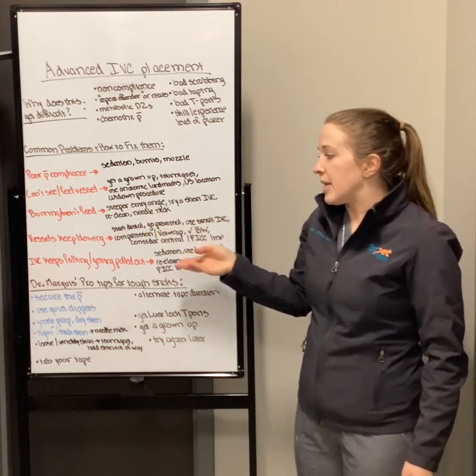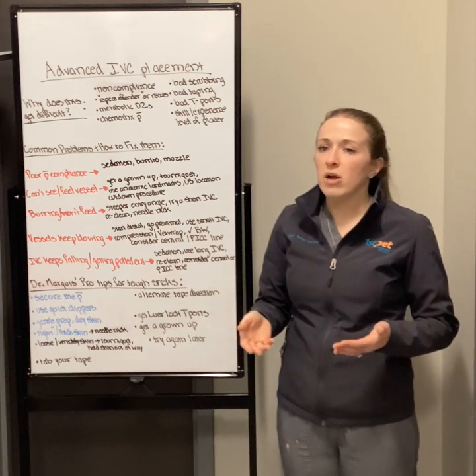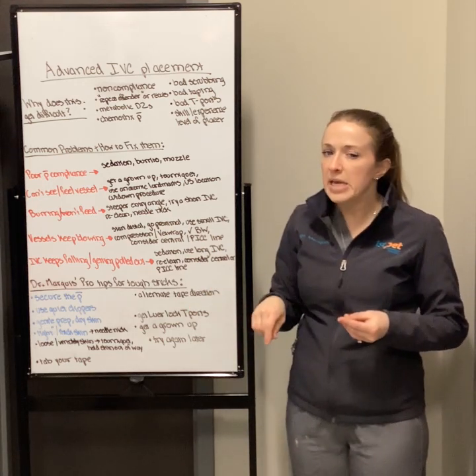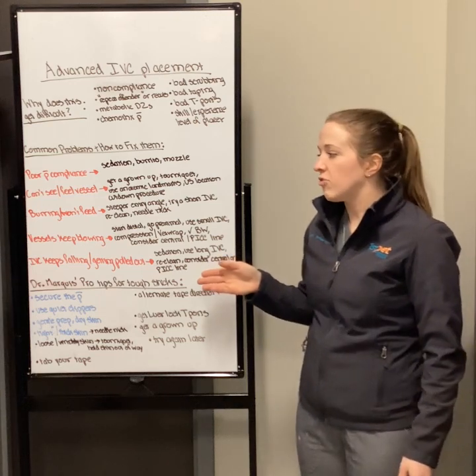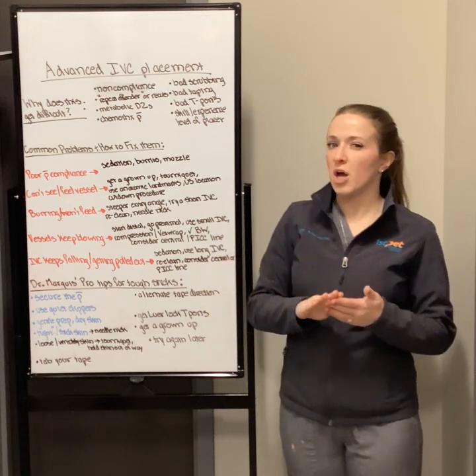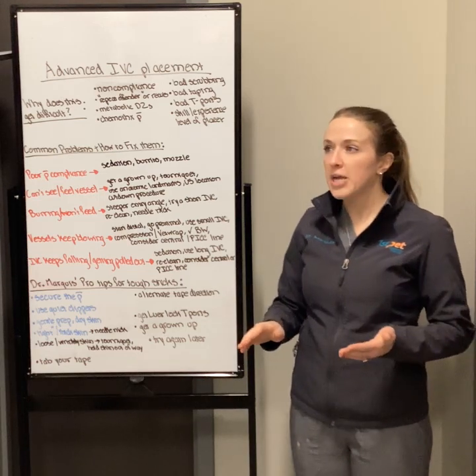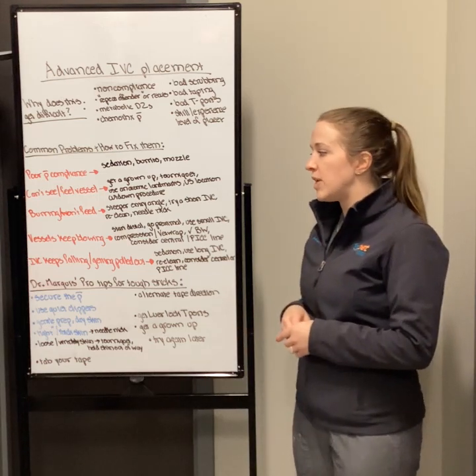A dirty leg or oily hair coat, or scurfy, flaky skin, can also be a big thing. If animals have very tough, oily or dirty skin, if they're intact, usually catheters will burr or they won't feed.